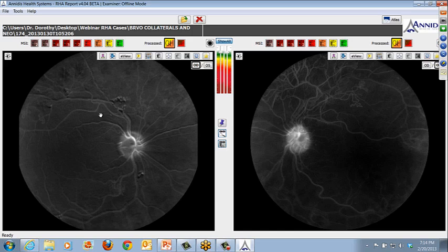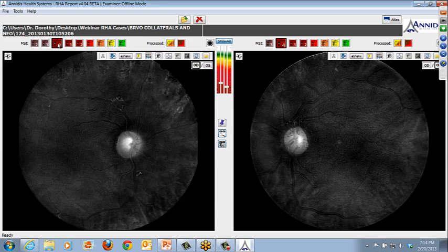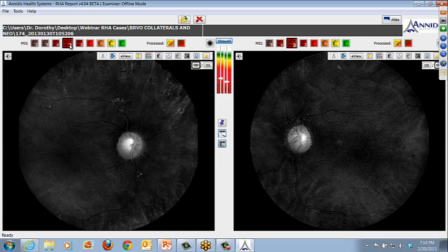So I'm not relying on this to help differentiate the vascular tissue, although having said that, I can use my own eyes here to see that there are a couple areas of concern, that the vessels are certainly more lacy, but there are a lot of collaterals. And if you move down into the reds, you can visualize the RPE, and you can see damage to the RPE here. It's highly focal and sort of not punctate, but highly regular, and so the patient has obviously had some prior laser treatment.